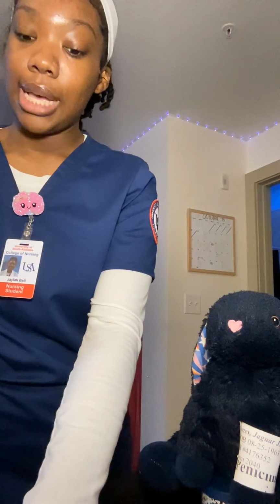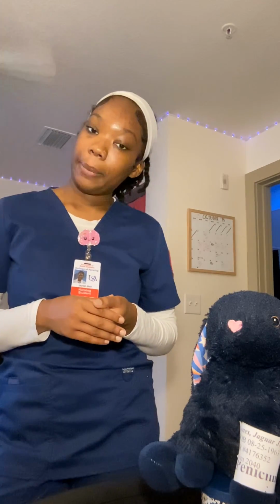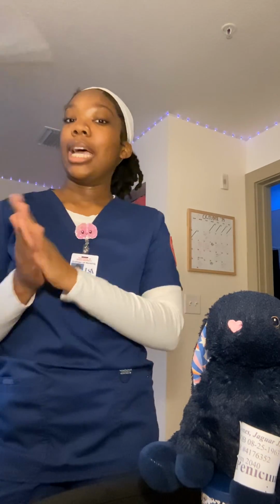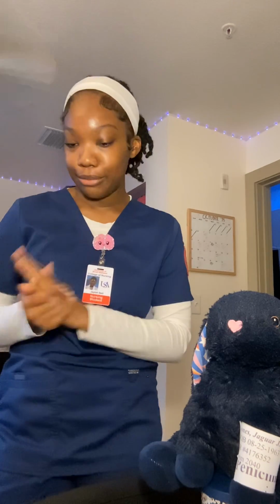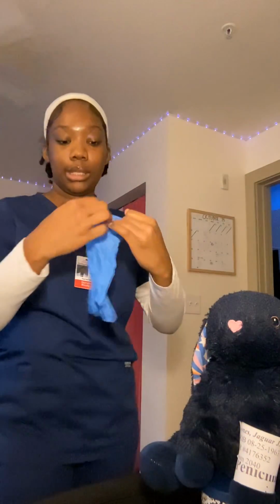For the right time, I'll be giving Mr. Jones his insulin 30 minutes before his next meal, and he's about to eat again, so we're good to give it. For the right indication, Mr. Jones is receiving his insulin before his next meal, so his blood sugar levels can be regulated. And as far as documentation, all elements of a legal prescription are included. Again, hand hygiene one more time, just to be safe. And I'm going to go ahead and put on my clean gloves.